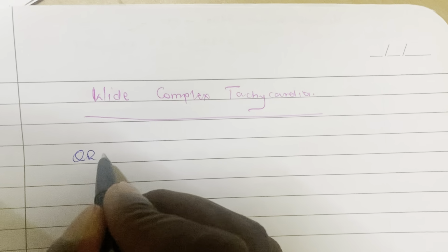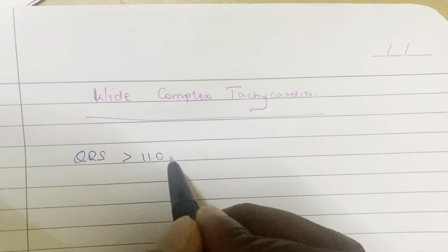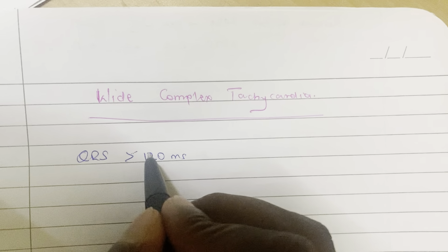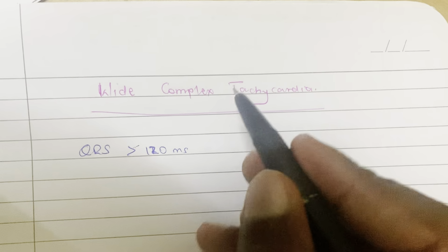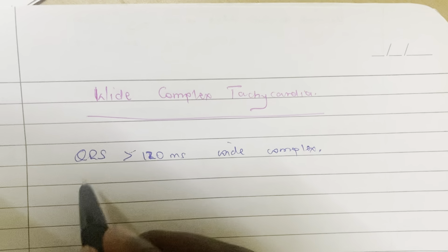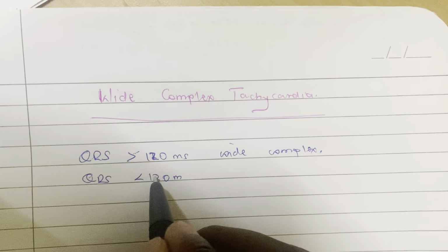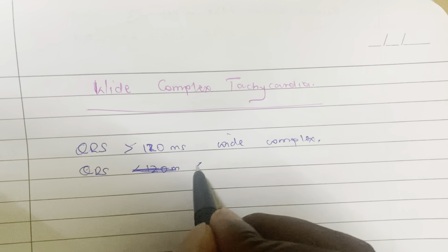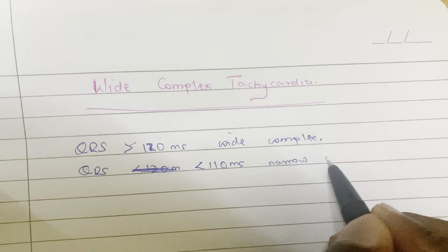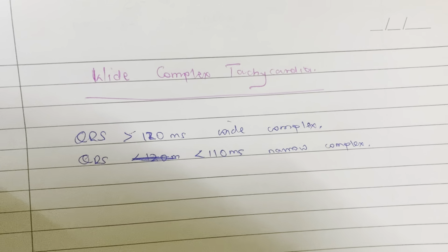We said a QRS duration on the ECG of more than 120 milliseconds is a wide complex, and a QRS of less than 110 milliseconds is a narrow complex.